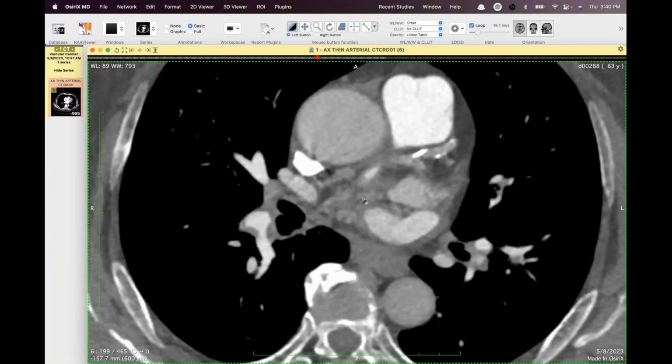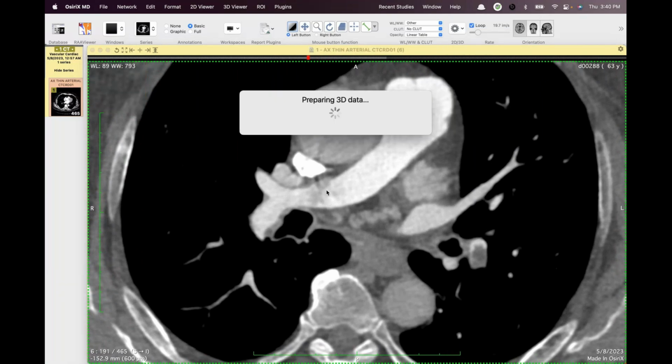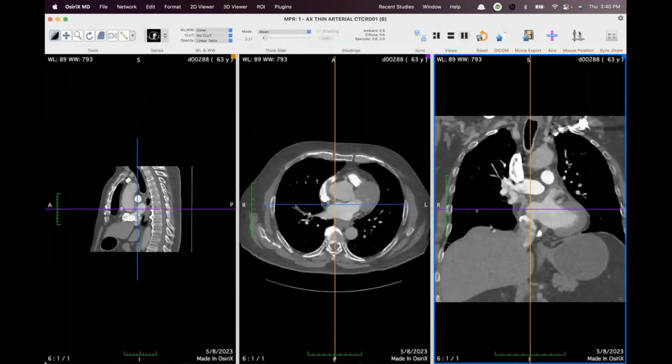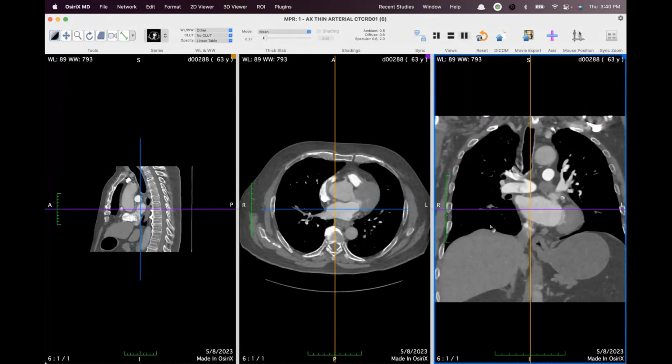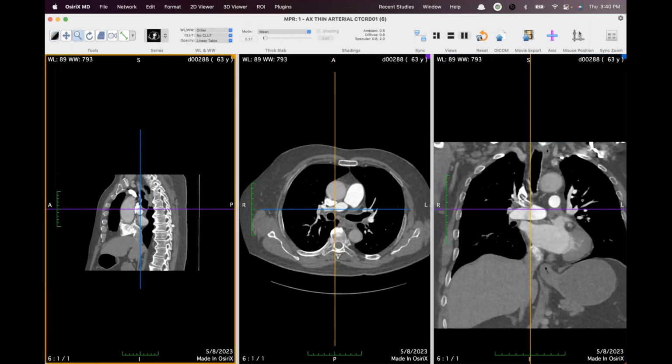You know, I had one from many years ago that was this distal. It was more conspicuous. It was associated with a big aneurysm, and they went from the PA side and just coiled it from the PA side interventionally, and that's all they did. But that's a very nice pickup.